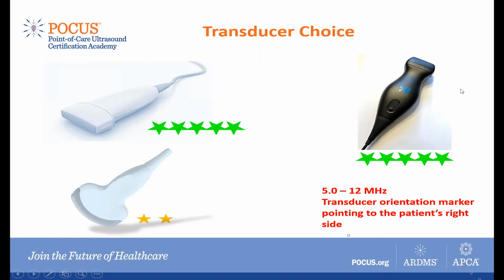The transducer of choice for this exam is going to be a high frequency linear transducer. As you can see, this is a high frequency transducer with a straight edge right here. And I would give it 5 stars for it.